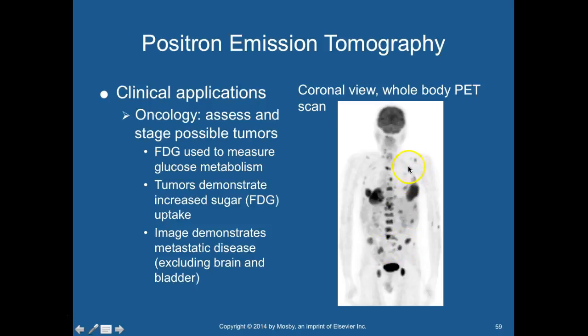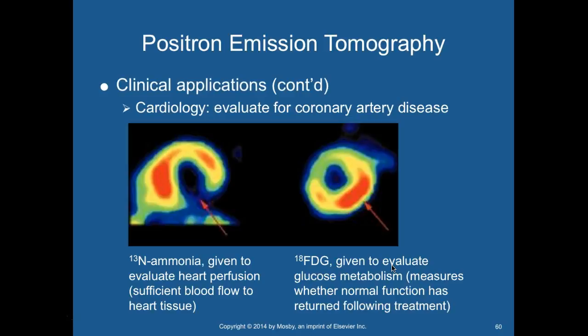You see lymph nodes up in here. Yeah, so the brain is enhanced. This patient is in a bad way. So FDG does get excreted by the kidneys, so you will see an increase in the bladder. So I like that they said that there's cancer, excluding the bladder. That makes sense. So here, it's filtered by the kidneys and concentrates in the bladder. So never use a nuclear medicine restroom. Keep telling you guys that, never use nuclear medicine restroom.